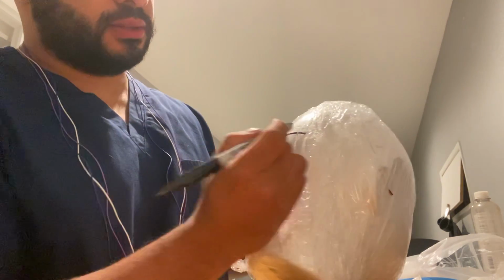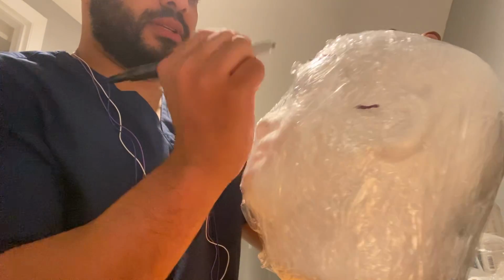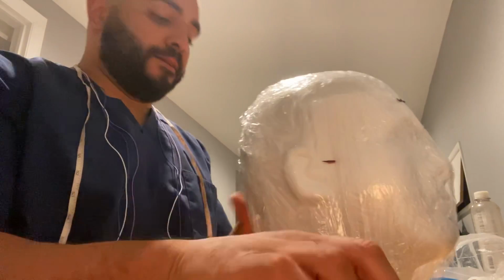I'm going to make this mark nice and long. So here we are, landmark, sagittal. Next I'm going to do the coronal.